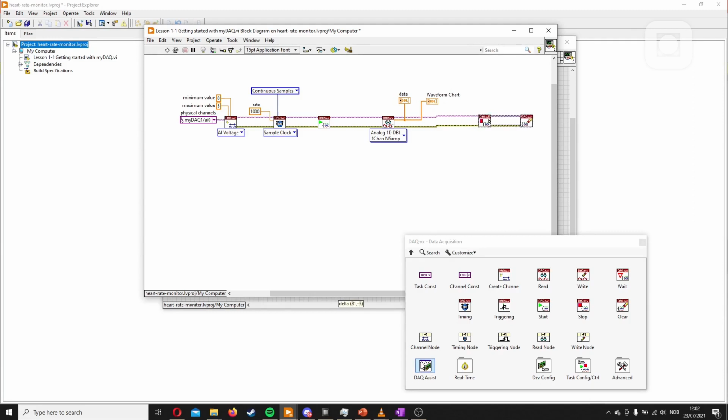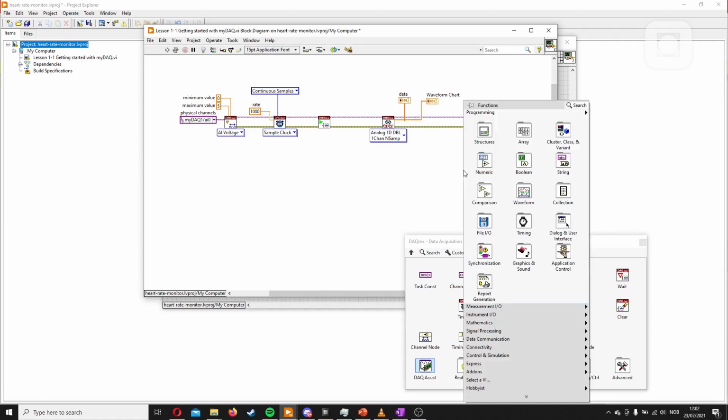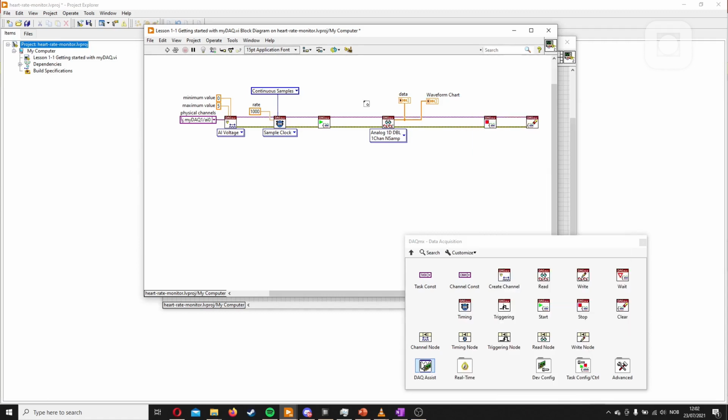And now we'll just move these a little bit. And what we want is actually this to run and read the data for as long as we want. We don't want it to just play, read, and then go here. So what we'll do is we'll add a while loop here. And then a stop.